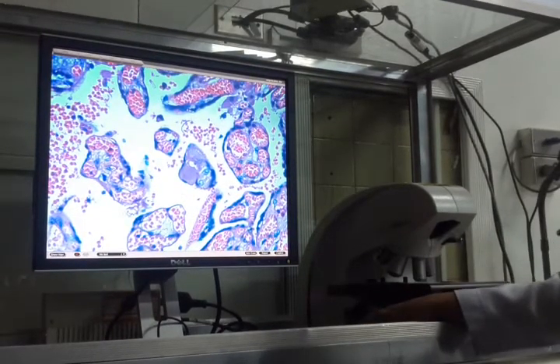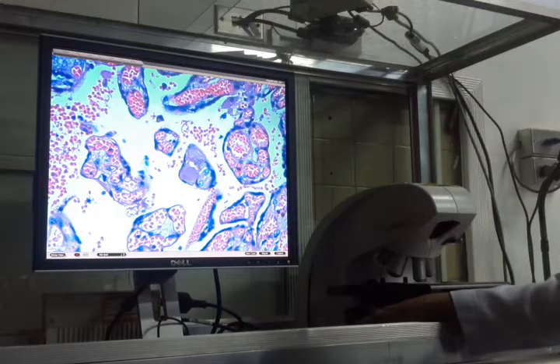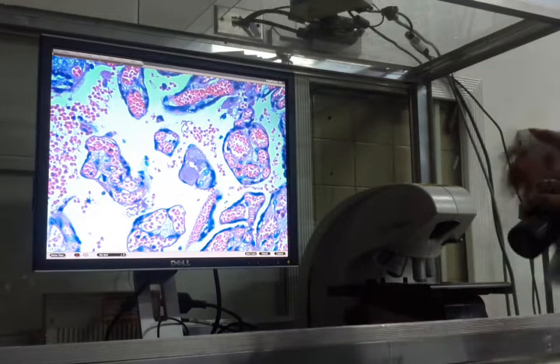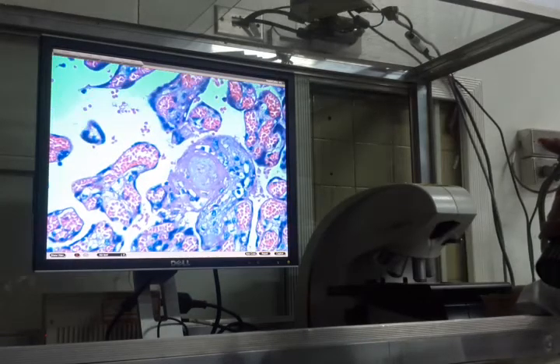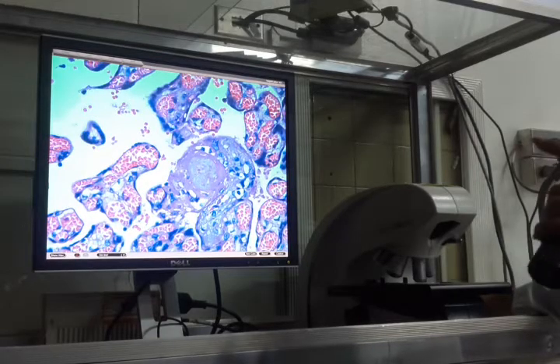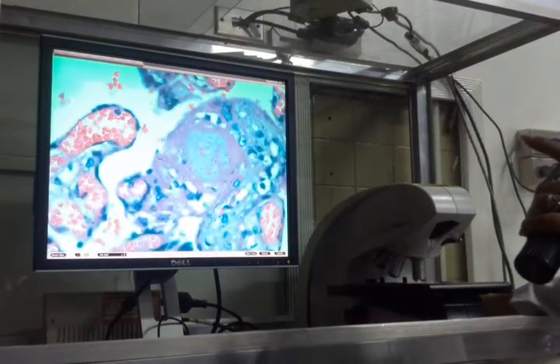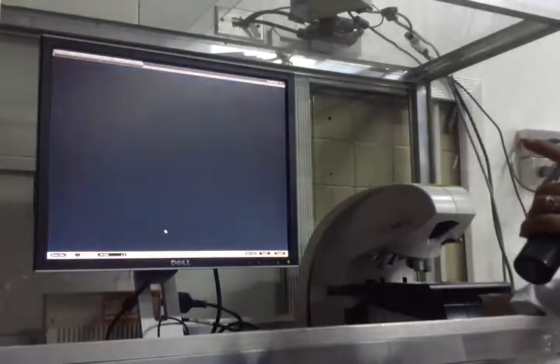Okay? Cytotrophoblast, syncytiotrophoblastic knot. Blood vessel, blood vessel, blood vessel. Lahat ng ganito, blood vessel within the chorionic villi. After all, your placenta is like a huge blood vessel. Okay? So you must recognize it without pathology, and that is what you have learned in histology.